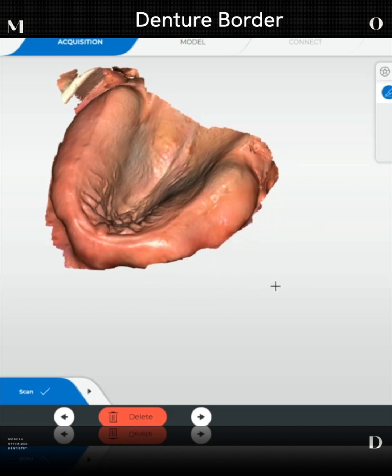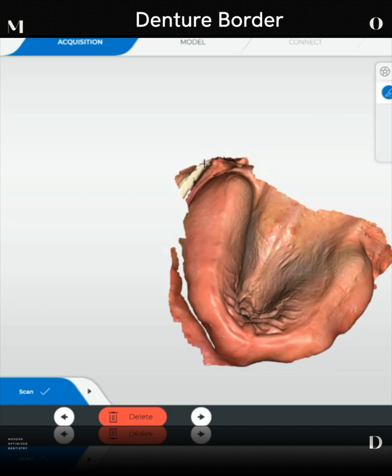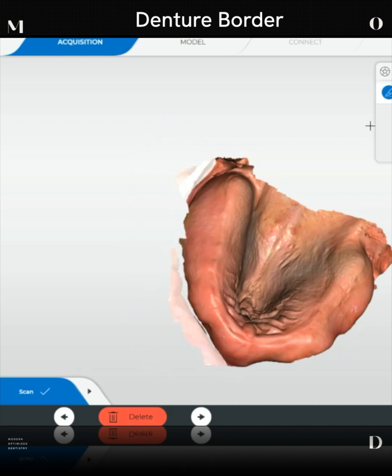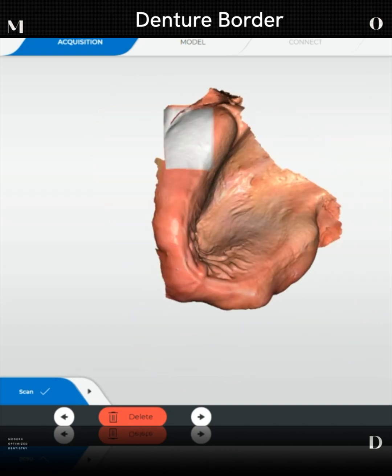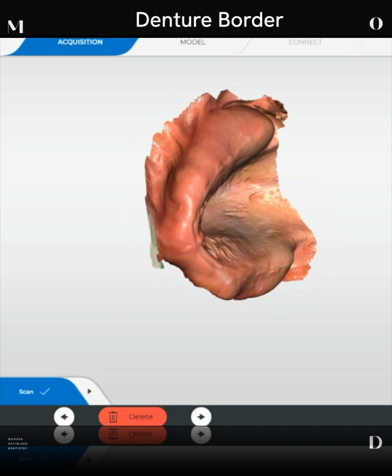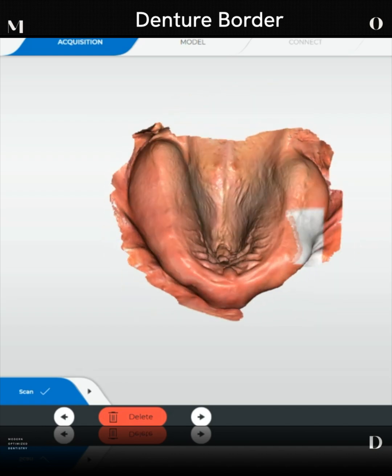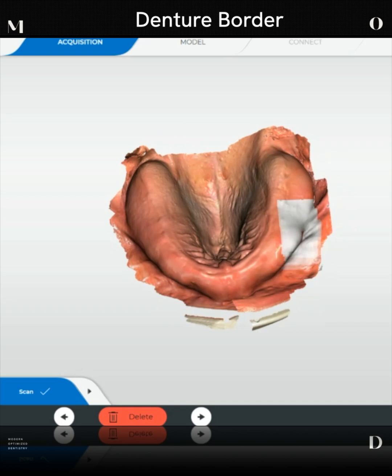What I like to do is get all my attached tissues first and trim any accidental scan of any movable tissues away. Then I very carefully get my retractors — we use special retractors designed for soft tissues here — and we get that in one swoop, hamular notch to midline, hamular notch to midline. The key is getting those tissues under tension so that you can see the muscle pleats when you're marking your borders, and also getting them in one smooth motion.